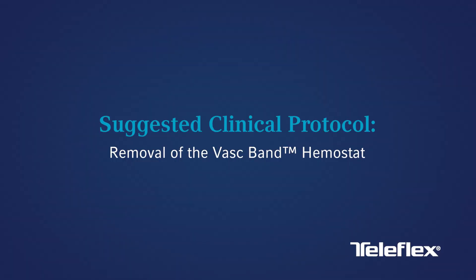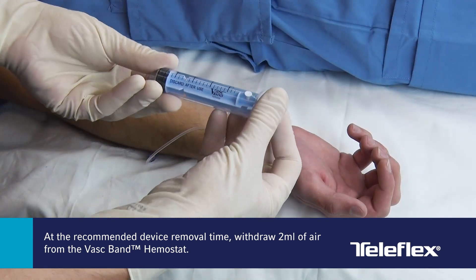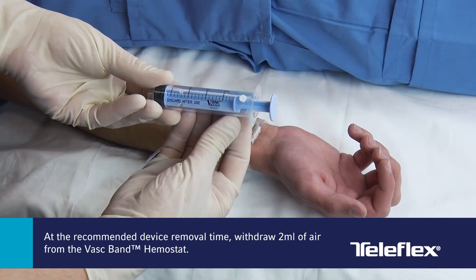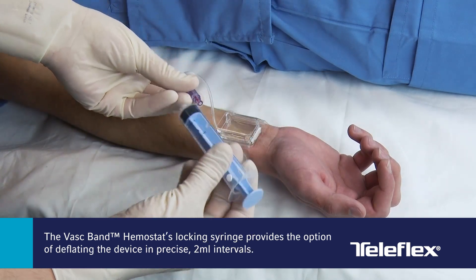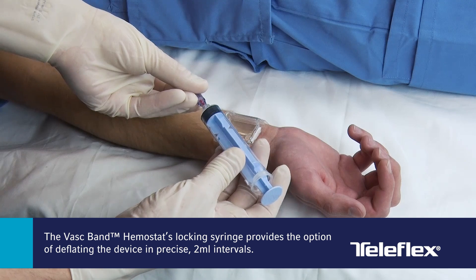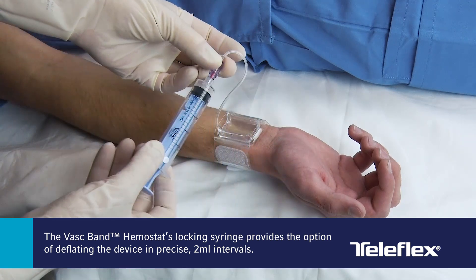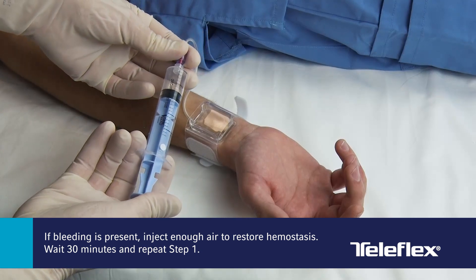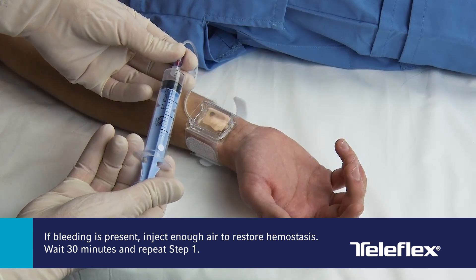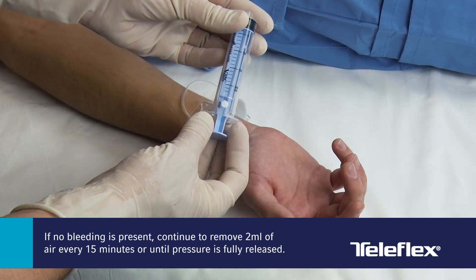Suggested Clinical Protocol — Removal of the VASC-Band Hemostat: At the recommended device removal time, withdraw 2 mL of air from the VASC-Band hemostat and observe the puncture site for bleeding. The locking syringe provides the option of deflating the device in precise 2 mL intervals. If bleeding is present, inject enough air to restore hemostasis and wait 30 minutes before repeating Step 1 of the removal protocol.